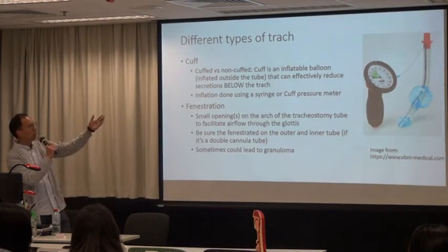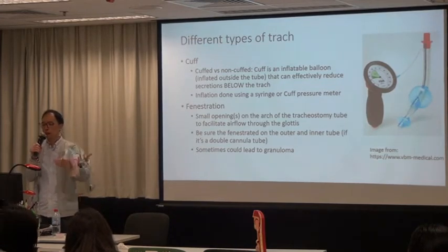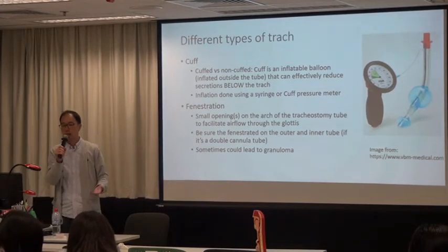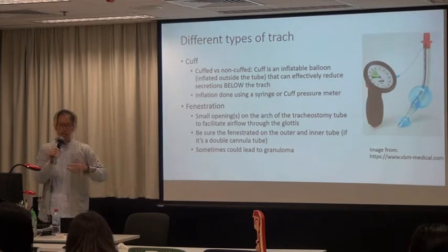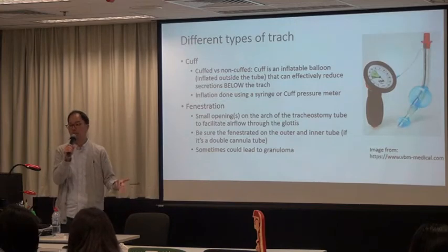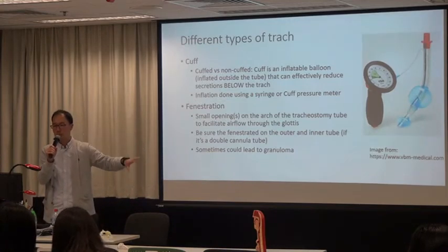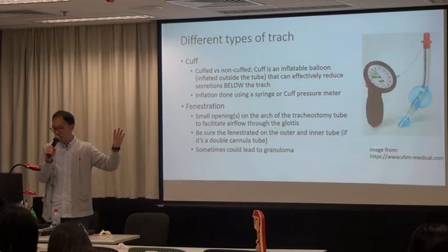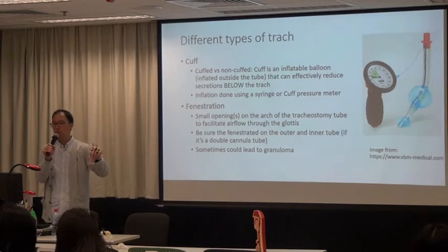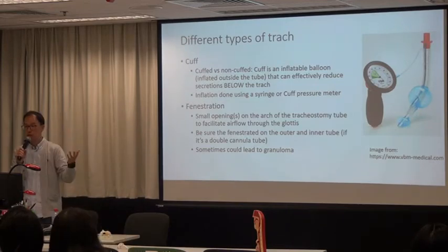Okay, so and the most important thing, when can the cuff be inflated, deflated? Ultimately, it's up to the doctor. Okay, it's up to the doctor. In some of our patients, we would recommend the cuff can be deflated. Okay, but I think that would be a very, very advanced thing. So let's put that aside. Just keep in your mind that whether the cuff can be inflated or deflated is up to the doctor's decision.